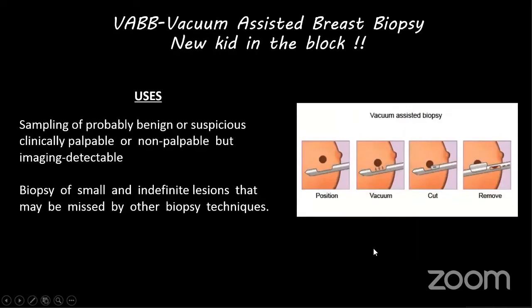So now a very new kid on the block of breast interventions is vacuum assisted biopsy. So what is vacuum assisted biopsy? It is not much available still in our country. Very limited places have this vacuum assisted biopsy equipment. How is it different from the core biopsy, and what are its indications?